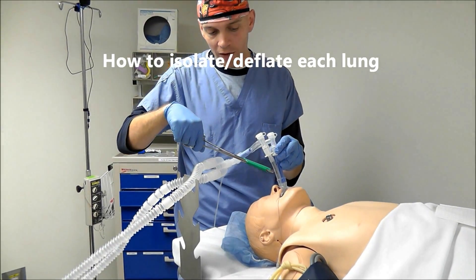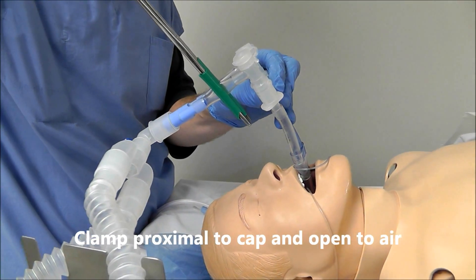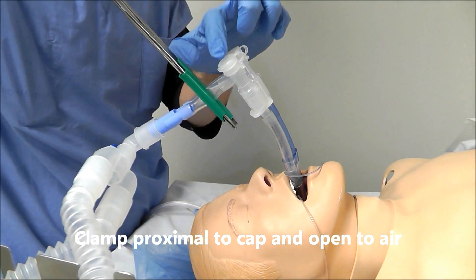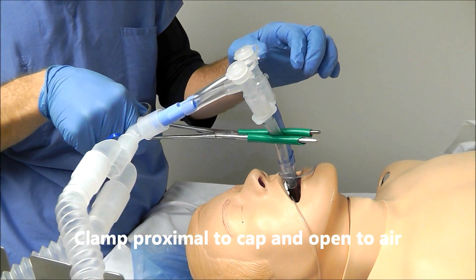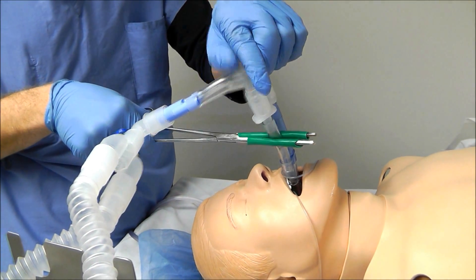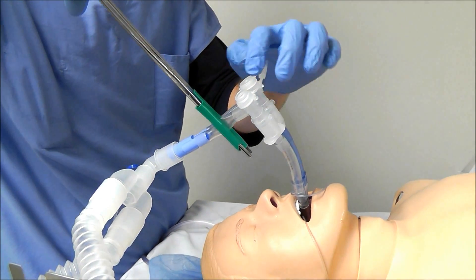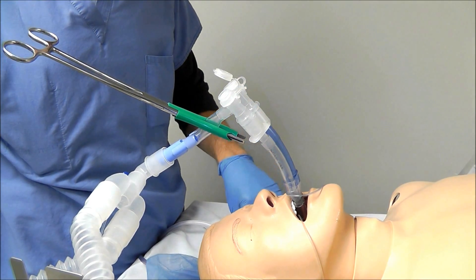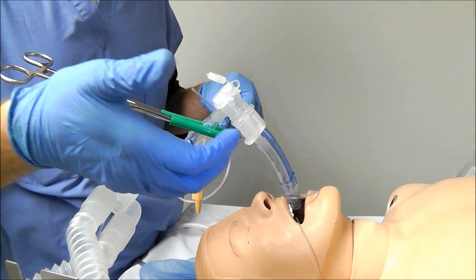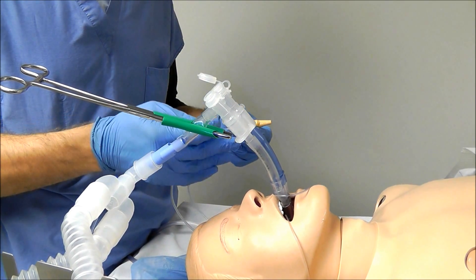To isolate a lung, clamp the double lumen tube proximal to the cap. You cannot clamp it distal to the cap because you need to be able to open the cap to atmospheric air — that's what allows the lung to deflate. Sometimes lung deflation will be a little slow and the surgeon will ask you to apply suction to the lung.